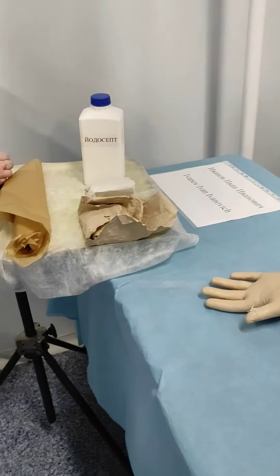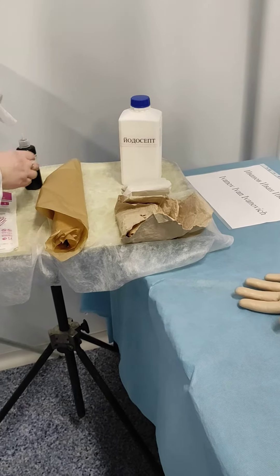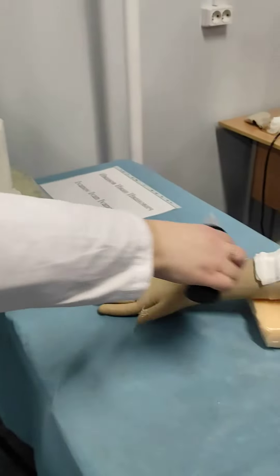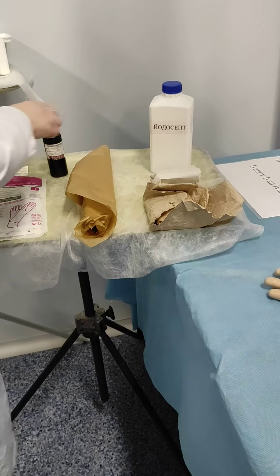But probably don't touch peroxide directly. I ask my assistant to apply peroxide on the top. Like this. Don't forget, open all packs.